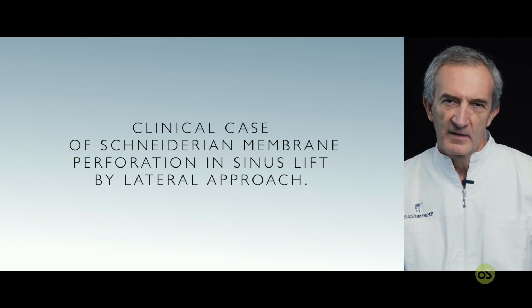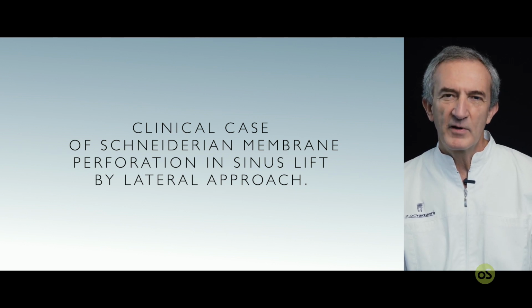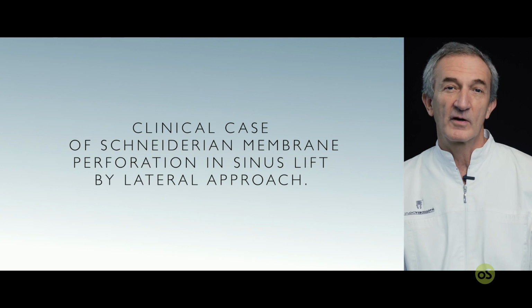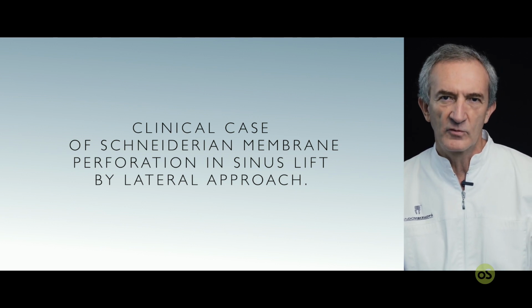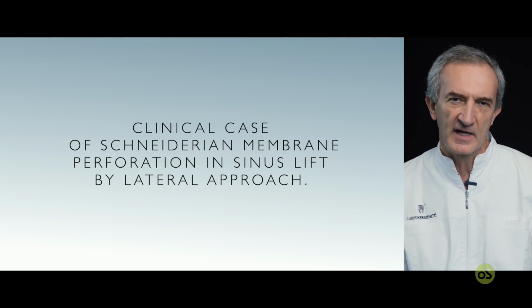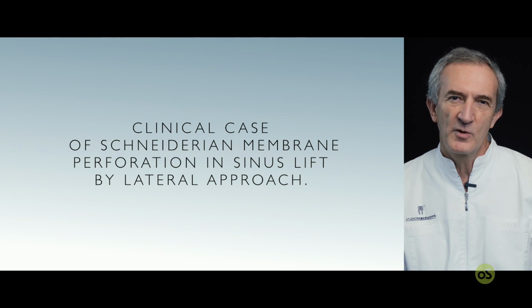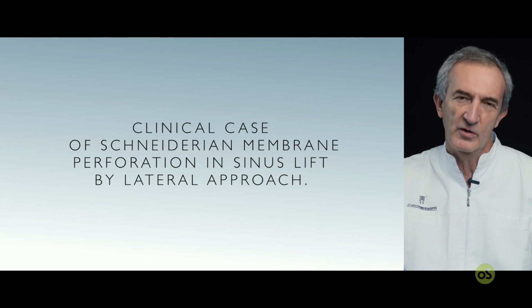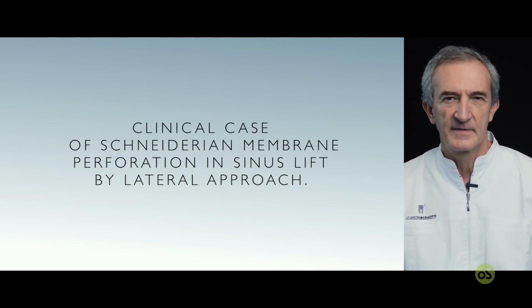For example, if we are doing a transcrestal approach and we create a perforation and we recognize it, the best solution is to stop the surgery immediately and to wait 3 months. Later, we could repeat the surgery in a successful way. Vice versa, if we have a small perforation in the lateral approach, it depends on which part of the frame it occurs. Sometimes it's possible to manage in an easy way, sometimes not.